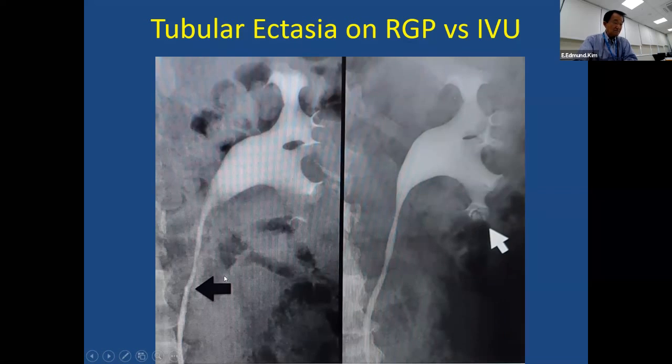Sometimes a urologist usually puts the contrast through the urethra and then demonstrates any stone, any obstruction, etc. But if there's certain parenchymal kidney disease, intravenous urogram is usually obtained.